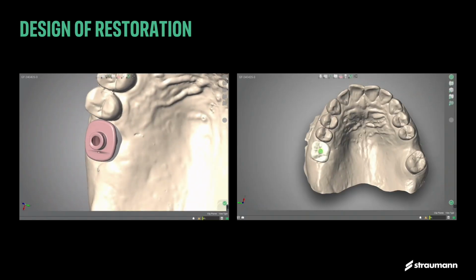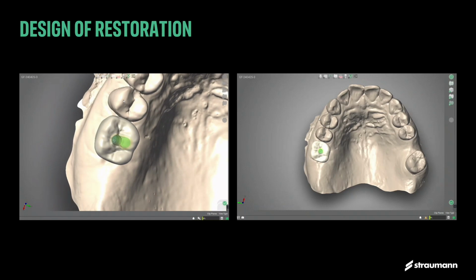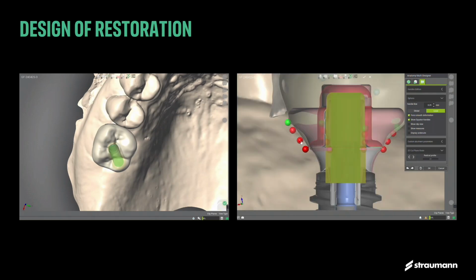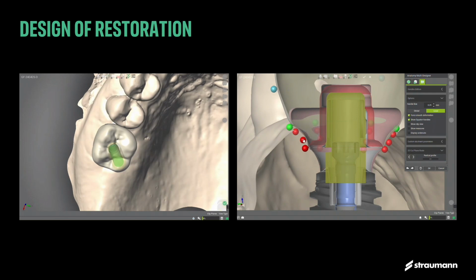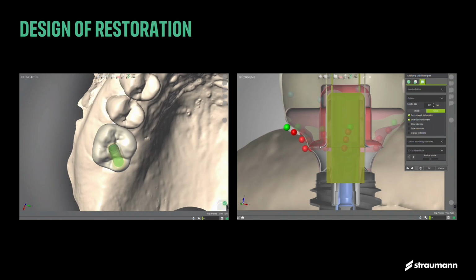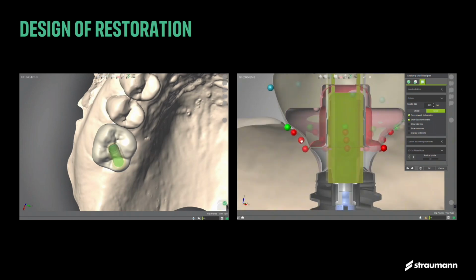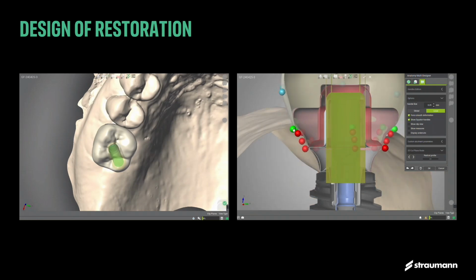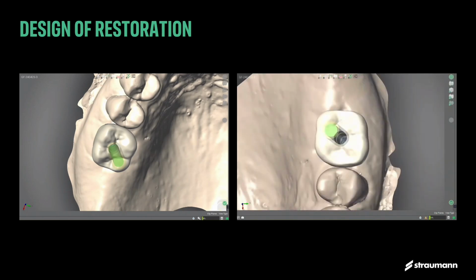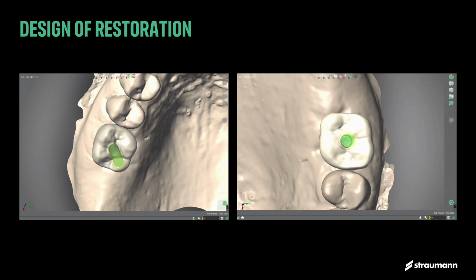This is already in the design software, and what you see on the right side, again, similar to the first patient, we're going to move this sideways, so there's a predefined shape of the gingival margin, just that emergence profile that we see already at the crown level. Then we're going to do some fine tuning, so the new crown will never push and pull the soft tissue. It will be matching one-to-one the anatomic healing abutment and the shape of the future crown. And this is what you see from the occlusal view.